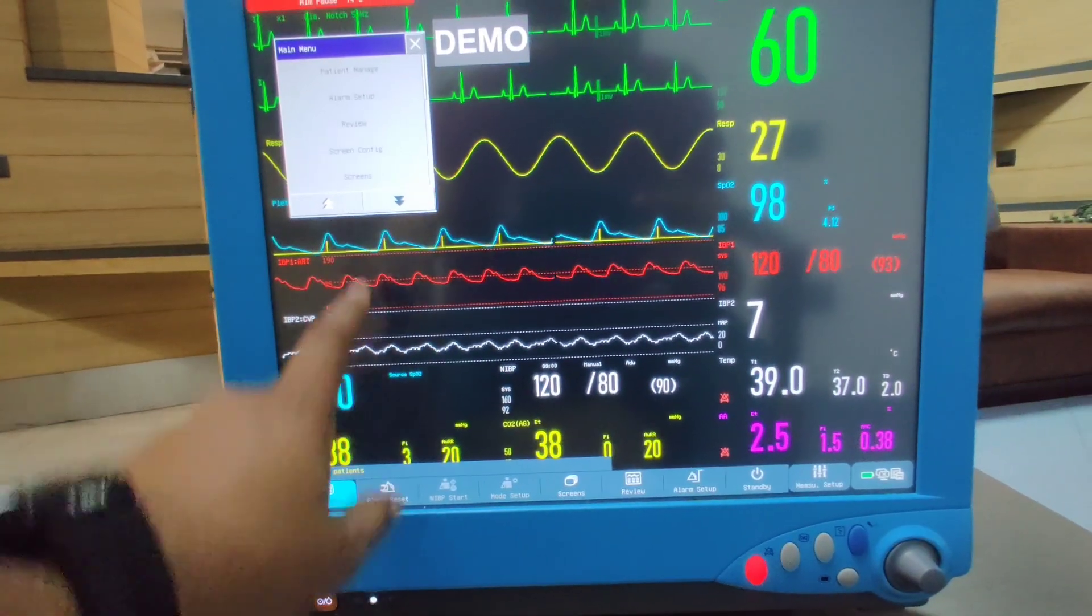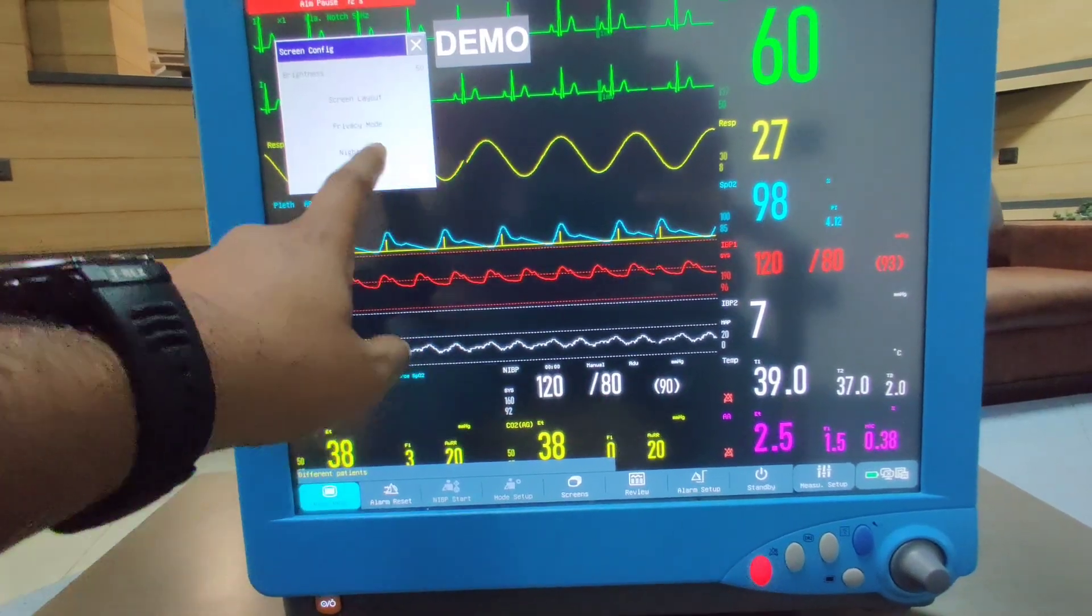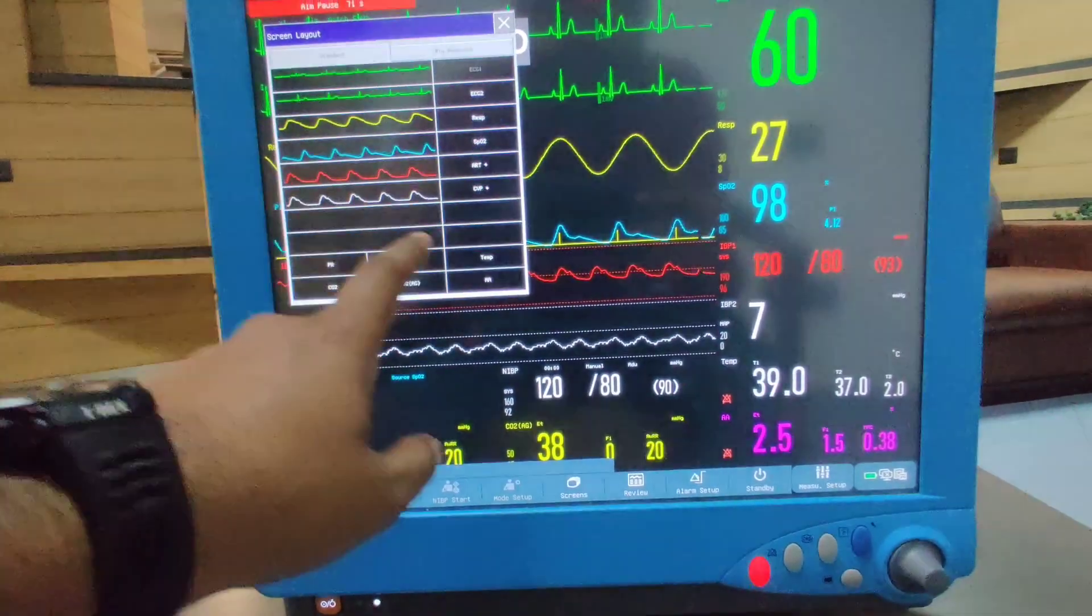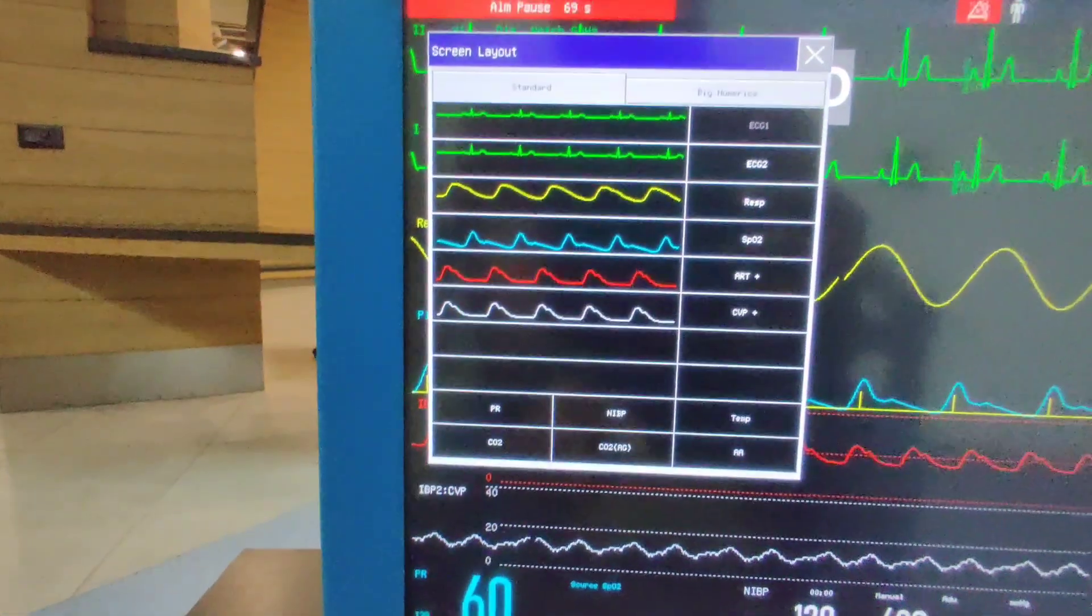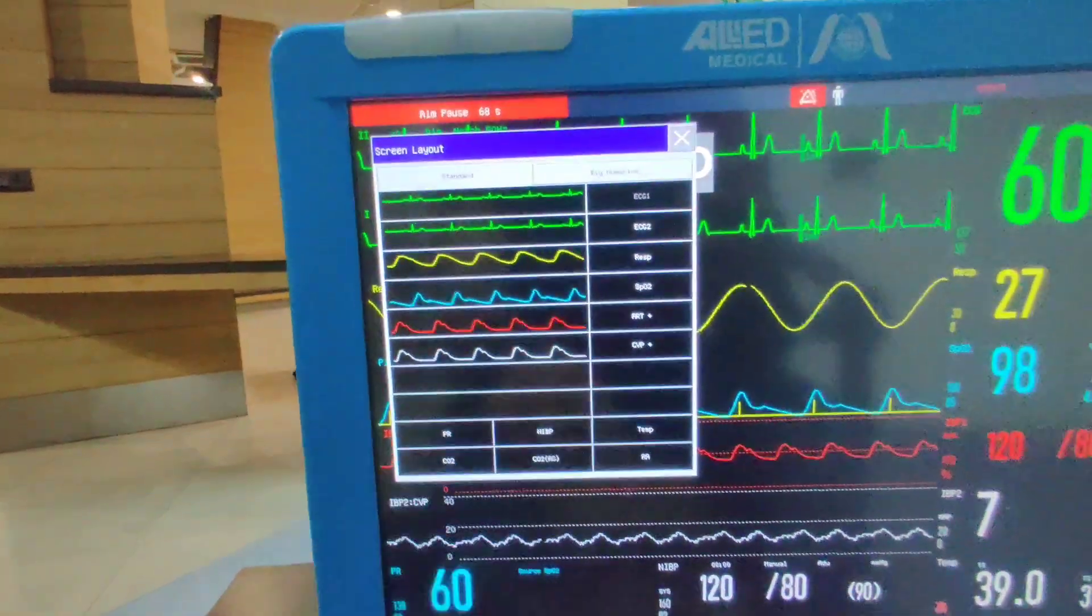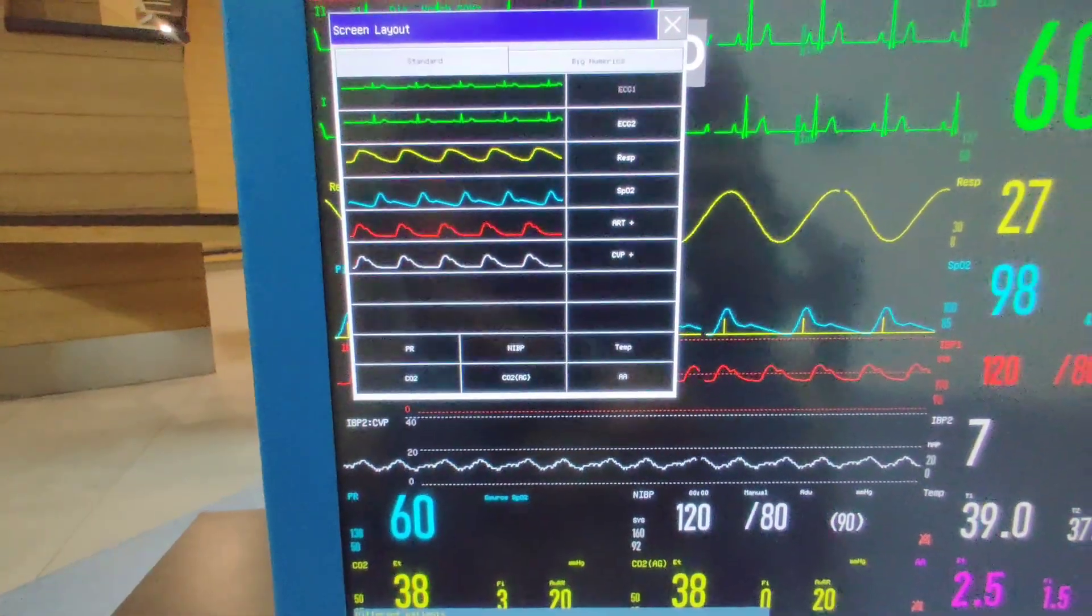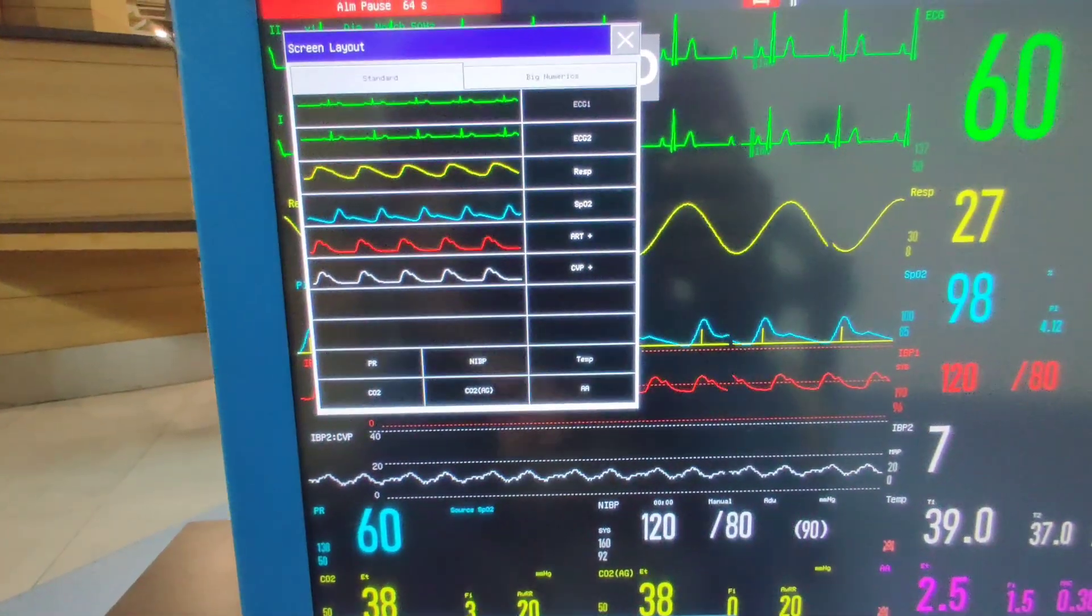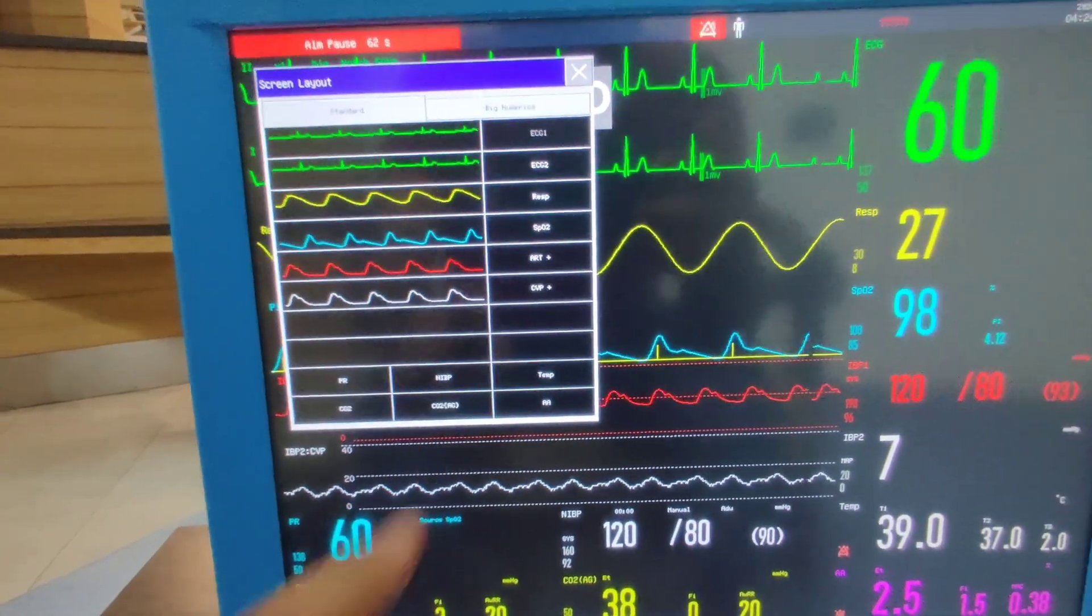You can go into the main menu, then screen configuration, then screen layout. As per the requirement, you can change the parameters position and move the parameters up and down.